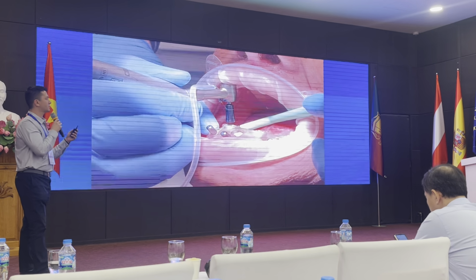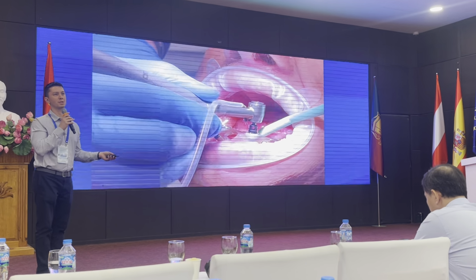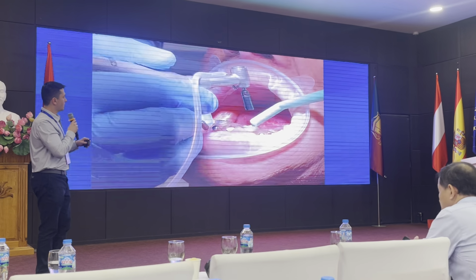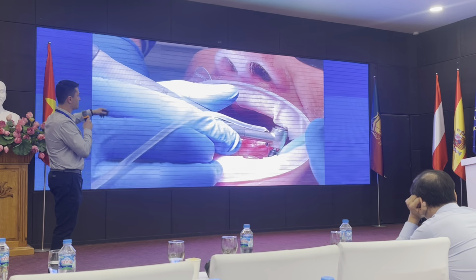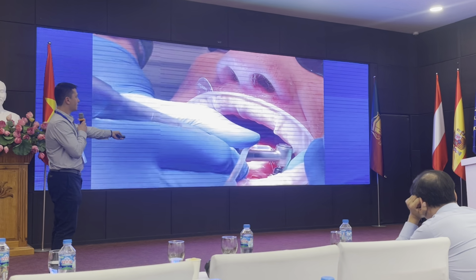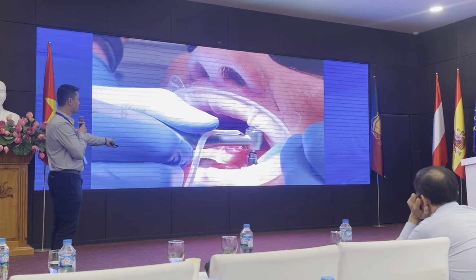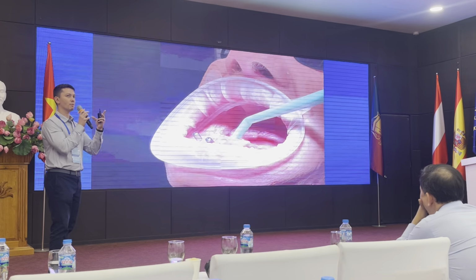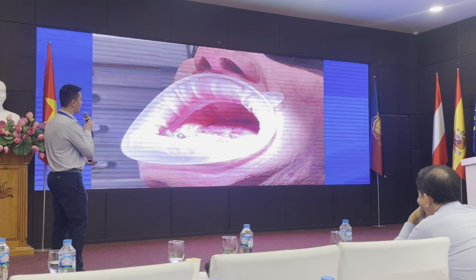This appointment goes so much quicker because all of the planning has been done, all the measurements have been done, the placement has been planned, and we just start going into each position. This is using the Z3D kit that Doug showed earlier, and it comes with this tissue punch that fits perfectly inside of each one of these holes. It's a snug, firm fit inside of the metal sleeves, and so it's very, very precise.